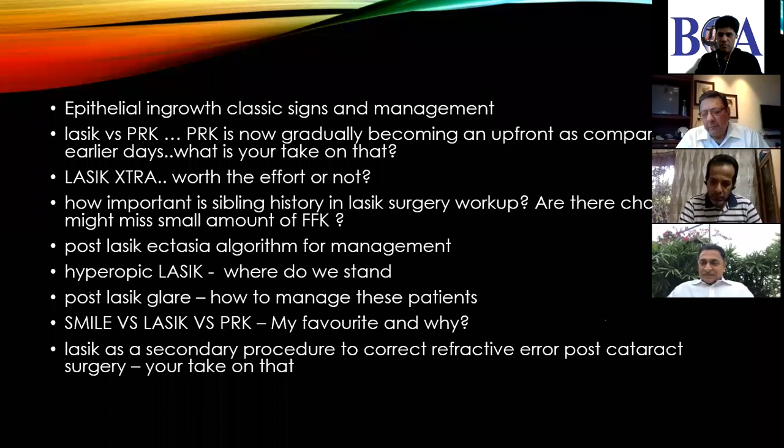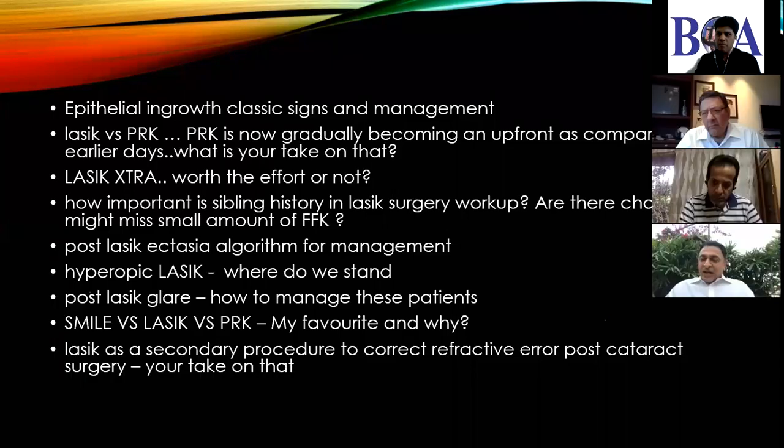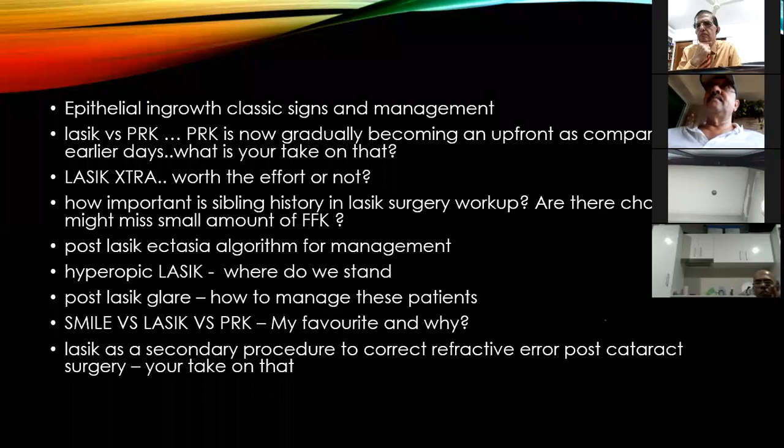Himanshu, do you do PRK, and what's your take on it? Yes, PRK, I've burnt my fingers. It's a nice surgery, very simple, doesn't have the sophistication of a microkeratome, and not having a femto saves you a lot of money. Having said that, after 100 or 200 cases you get infiltrates, and if the patient is in trouble, you have a lot of reaction and delayed healing time.